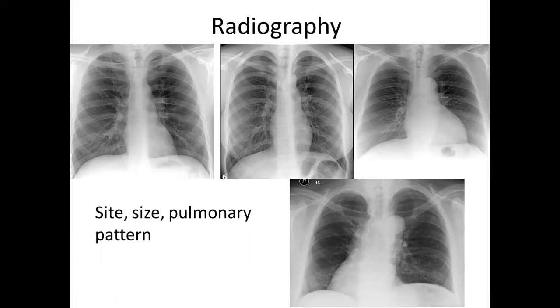So take your time, spend your time on understanding and reading anatomy, because without it you couldn't understand what will happen on the x-ray. And here are some normal variants of the heart depending on the patient's constitution.